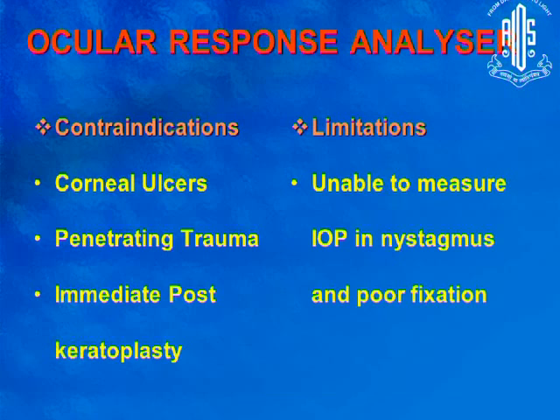We cannot use it in patients with penetrating trauma, corneal ulcer, or post-keratoplasty. Limitations: it is unable to measure IOP in nystagmus and in patients with poor fixation, and it makes a terrible noise which sometimes alarms the patient, and they don't cooperate with the procedure.